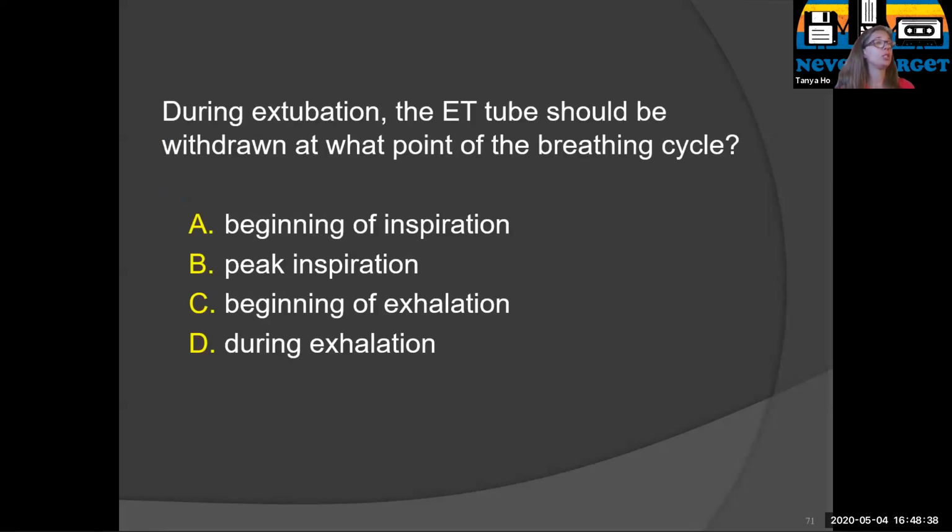During extubation, you want to extubate at the peak of inspiration. So what will happen is you'll be like, okay, are you ready? They're like, yeah. And then you go, okay, big breath. Usually we take a couple of deep breaths, and as soon as they go to exhale, you pull the tube out, and that way they're kind of coughing it out at the same time.